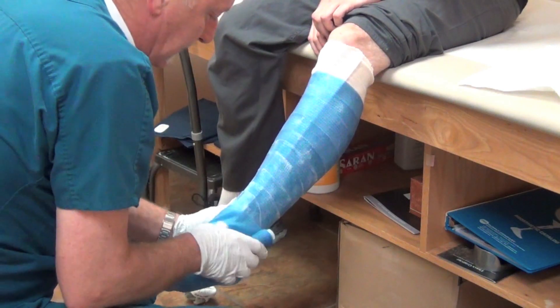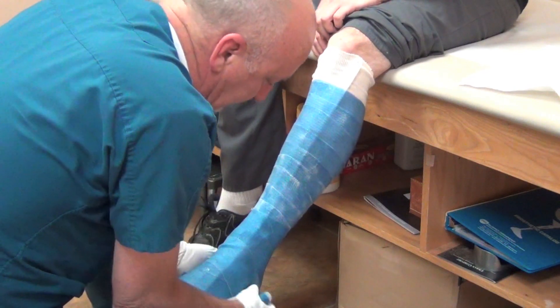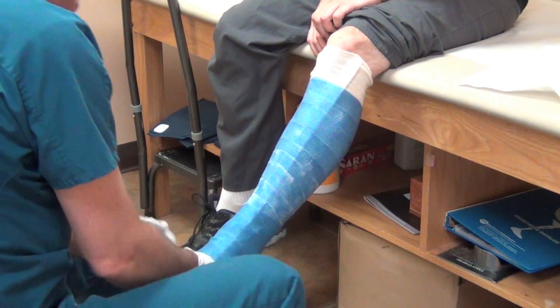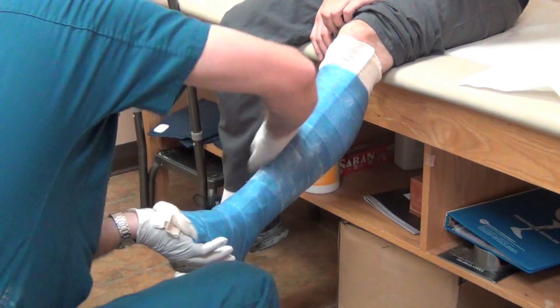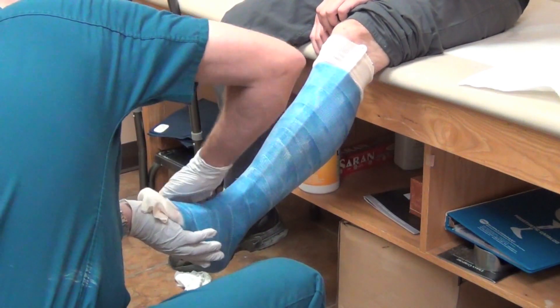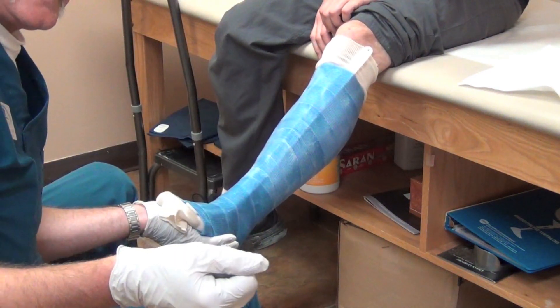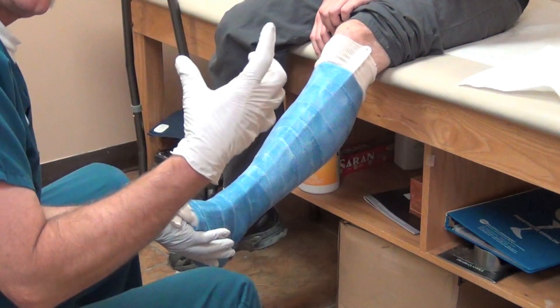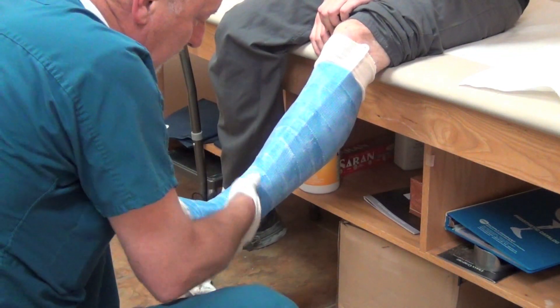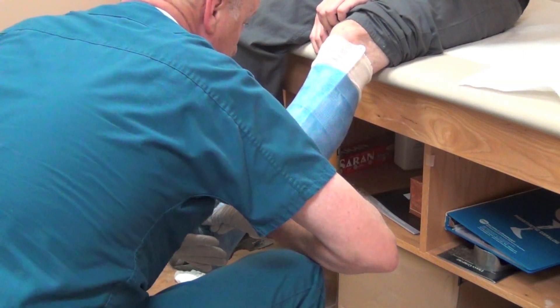I know a lot of people pride themselves on getting the whole foot in one 4 inch or 5 inch roll, but believe me, that's just not the best cast. Once you get it on, massage it in, get good contour, make sure there's no bridging of material. When you stretch the casting material, it can bridge across the malleoli and make them look less prominent because it doesn't follow the contours. When you just lay it on, it really does follow the contours well.